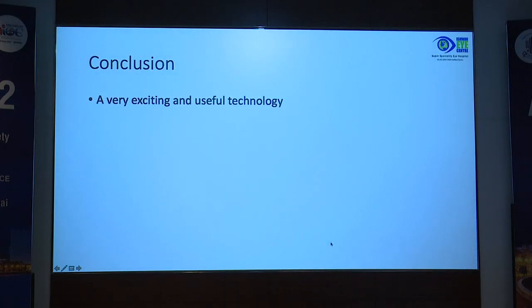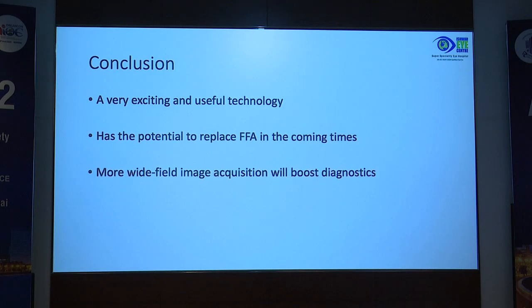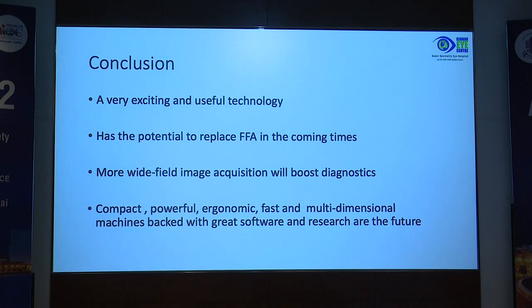So in conclusion, it's a very exciting and useful technology, and has the potential to replace angiography in the coming times. More wide field image acquisition will boost diagnostics, even for uveitis cases. Compact, powerful, ergonomic, fast and multi-dimensional machines backed with great software are the future.